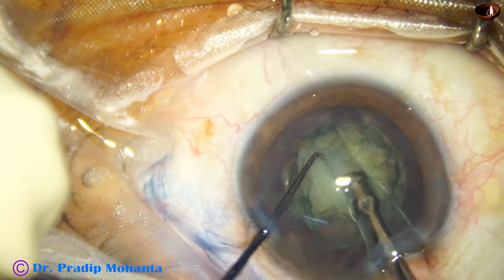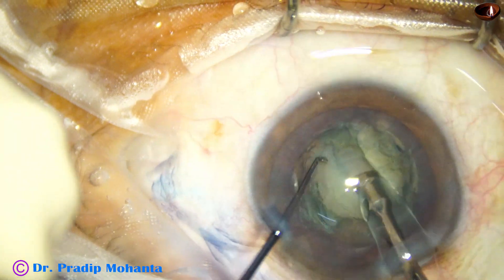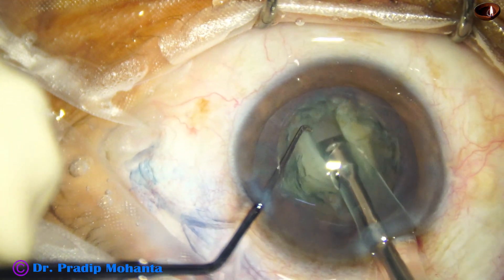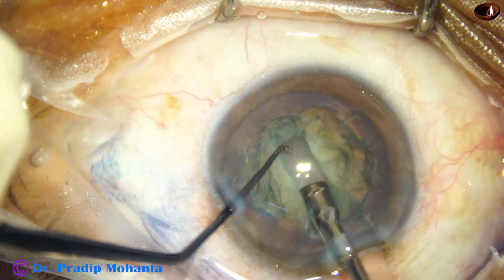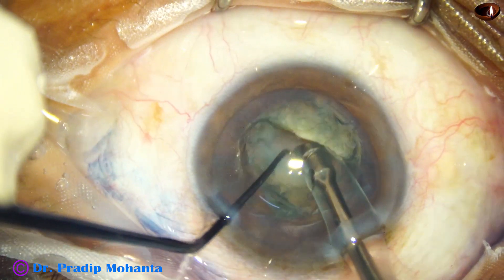The nucleus has been rotated and sculpting is being done on the other side of the trench. When a faint red glow is seen at the bottom of the trench, it means adequate depth has been achieved. Now let us divide this nucleus into two heminuclei.